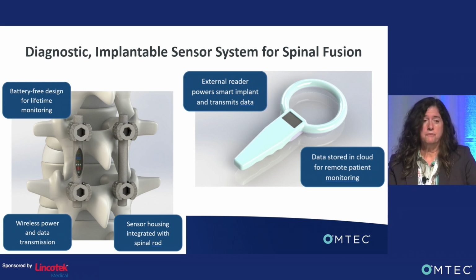So first and foremost, this is a battery-free design, and I'm using wireless power for the device. And the reason that I'm doing that is because spinal implants are not typically removed after the fusion has formed. They remain in the body, and I don't want any harm to come to the patient over time, if 20 years later, if this were to leach out. But also it gives you the ability to monitor changes in the fusion, because we know that if you do a spinal fusion, the end-plate loading changes, etc. And so you could see that if you had a battery-free design.